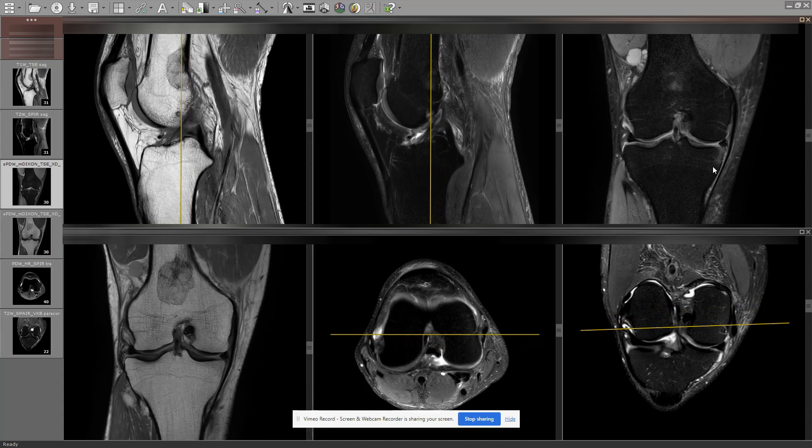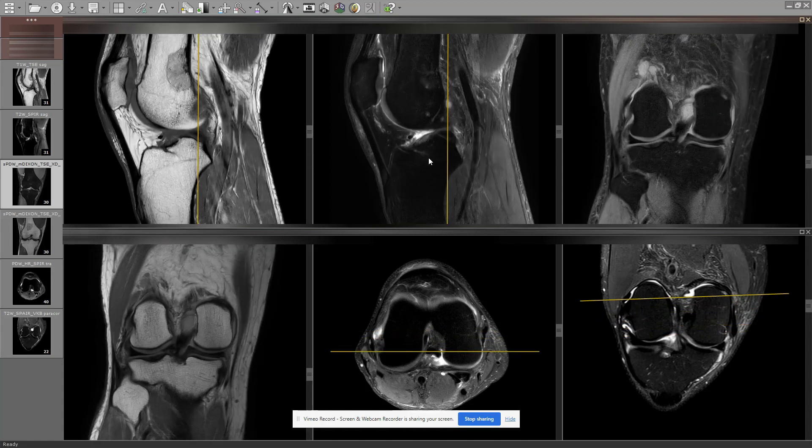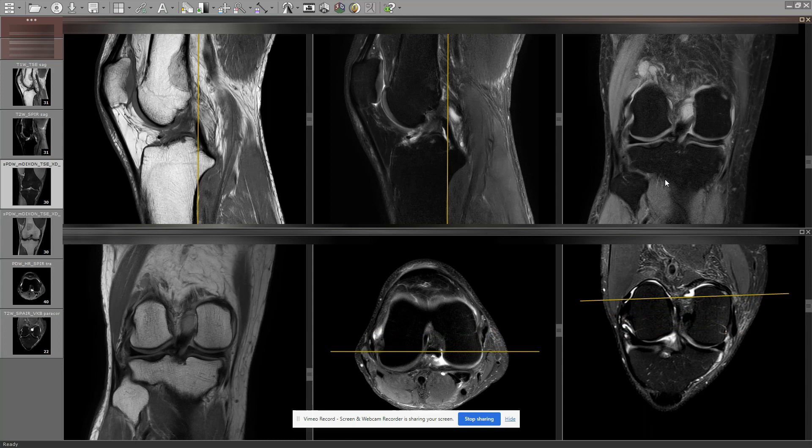Dünnes antromediales VKB-Bündel, beide Bündel intaktes VKB. HKB intakt.